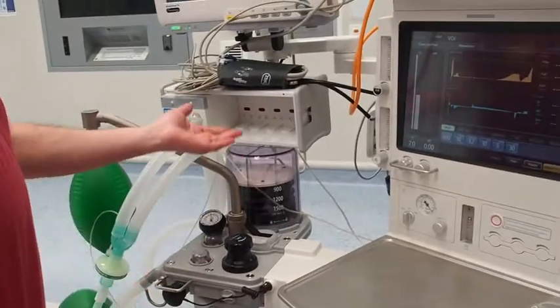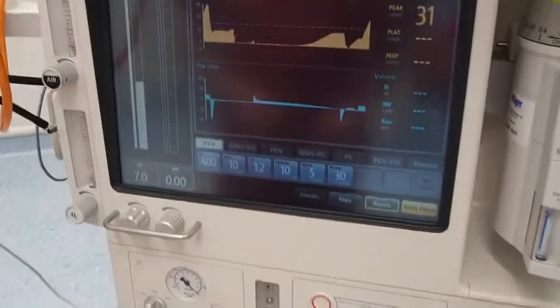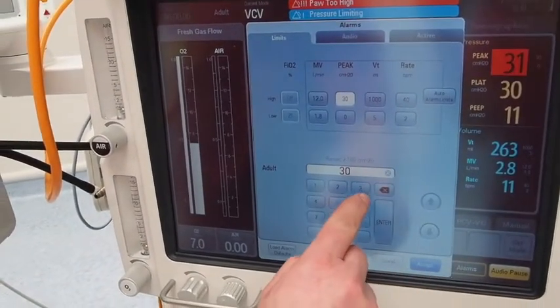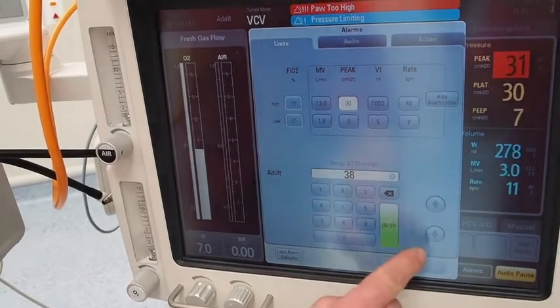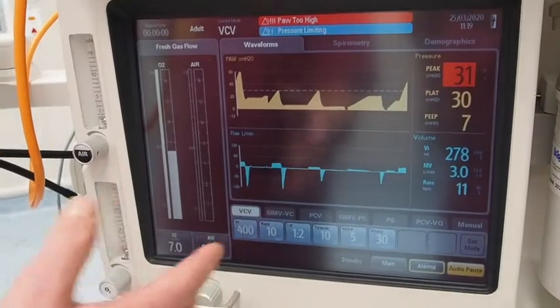And what will happen now is this machine will ventilate by default on volume control ventilation. Now this is alarming because the bag compliance is very poor. So I'm just going to change the alarms here, and everything is touch screen. You just touch the screen and change the alarm and press enter.